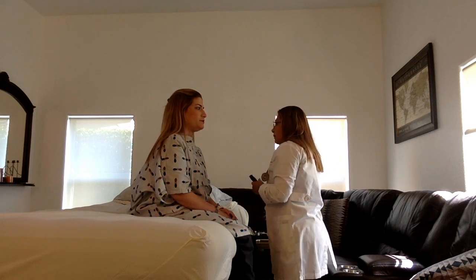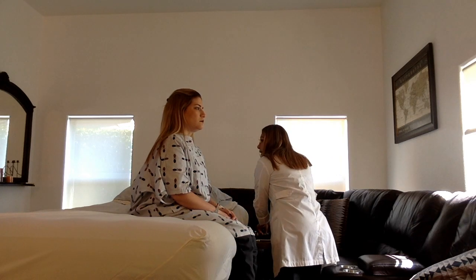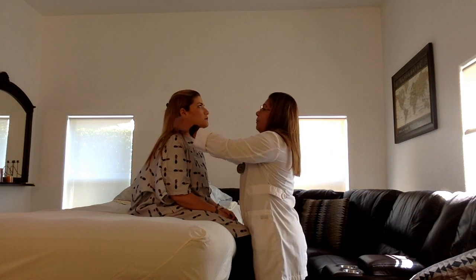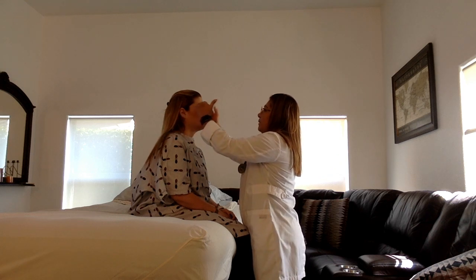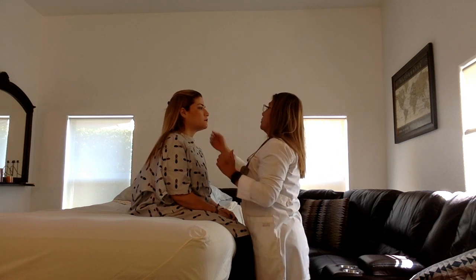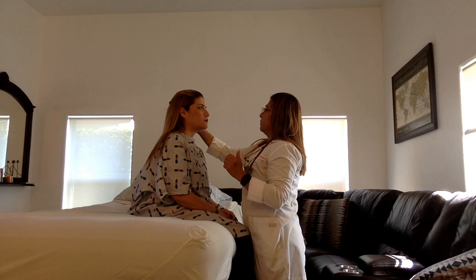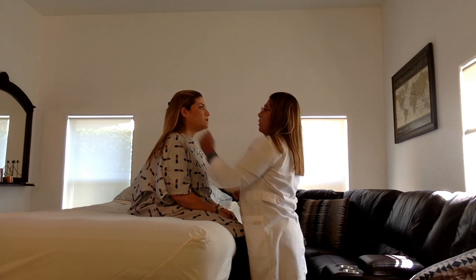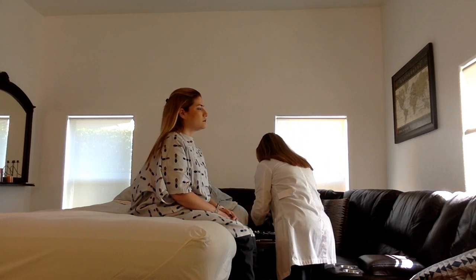Okay? Then for now, I'm going to check your ears. Your ears are symmetric, equal in size, and in line with the eyes. I'm going to do a test, and you're going to tell me if you feel any pain. It's called the tug test. Do you feel any pain? No. Do you feel any pain? No. Okay. Now I'm going to look inside of your ears, and let me just get ready.